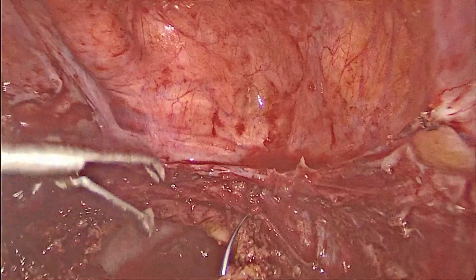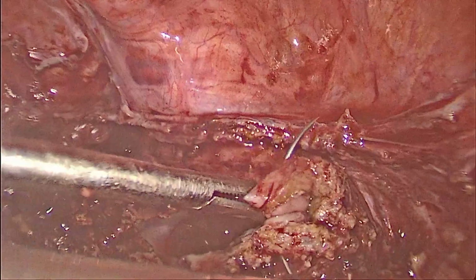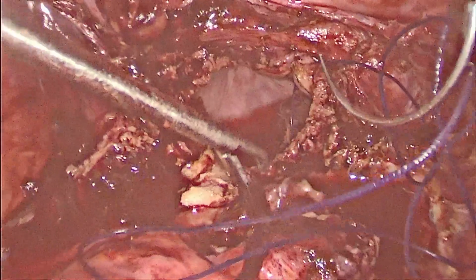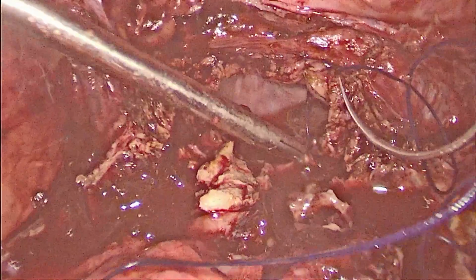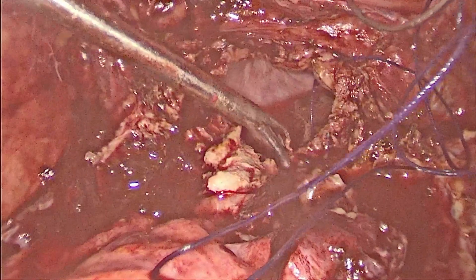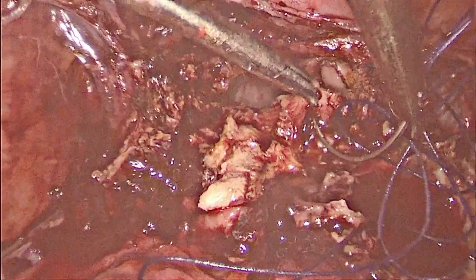Now we are approximating the vault using number 1 Vicryl, with attachment of the uterosacral ligament to the future vault of the vagina. We can see how friable the tissue is due to the inflammation.